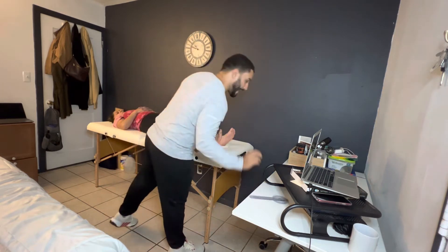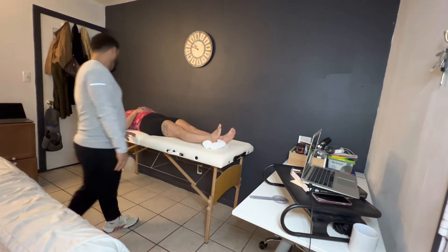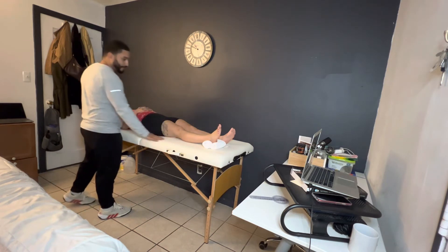I'm going to go ahead and grab this towel and place it under your foot so we can go ahead and measure our knee extension. Is this a comfortable position for you? All right, perfect. What I need you to do is the same thing we just did with our right leg, except the opposite of flexion — we're going to go ahead and extend our leg into the bed about three times.